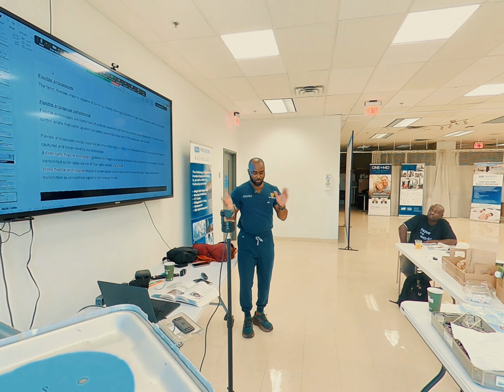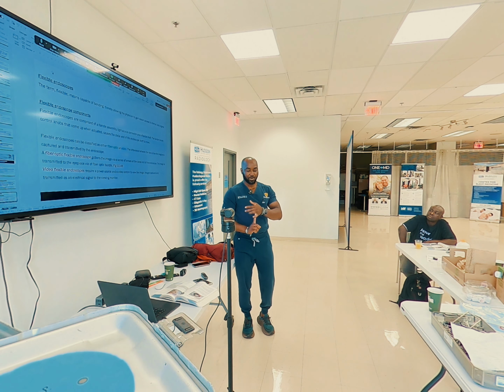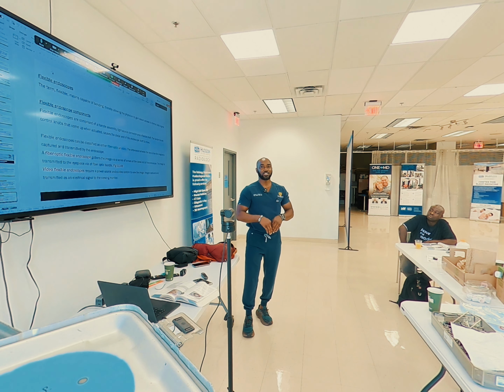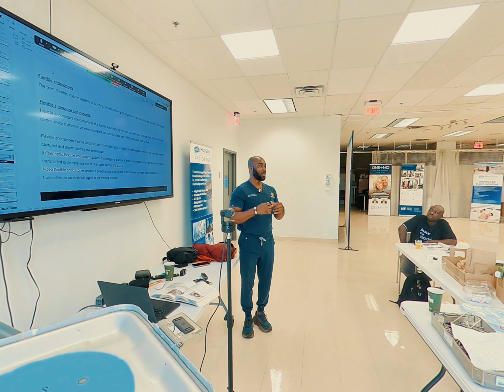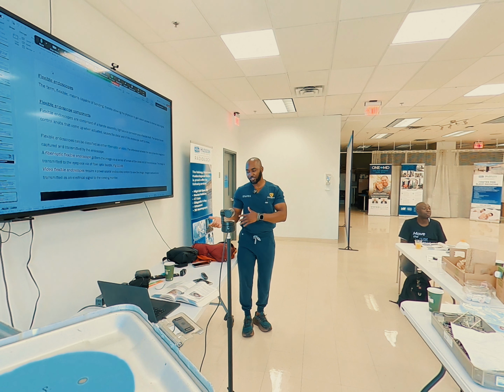So a true or false question would go this way. One can perform a manual high level disinfection if they do not have an endoscopic reprocessor. That answer is true. You can do that if you don't have it. And your answer will be false if it says one can perform manual high level disinfection if he has an AER in his facility. That answer is false. You hear how the questions go?